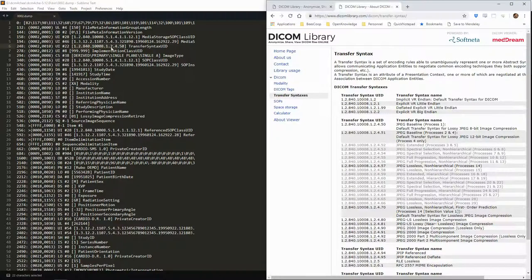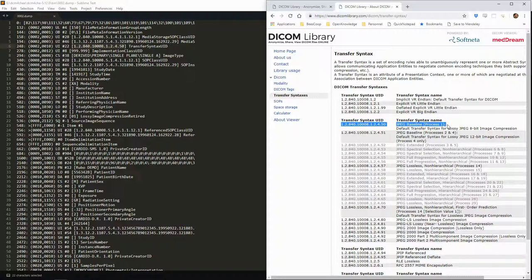We can always use the documentation to interpret the tags and also to interpret the value of the UIDs. For instance, we can here see that this transfer syntax UID corresponds to JPEG baseline.